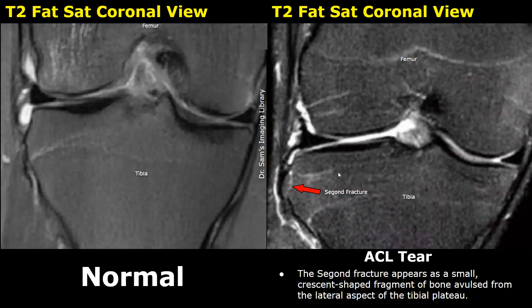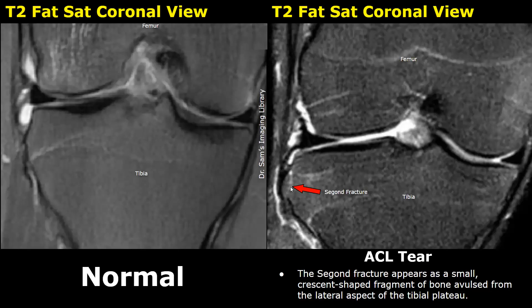Here is another image of a Segond fracture. We can see a small, crescentic-shaped, displaced fragment at the lateral aspect of the tibial plateau. Segond fractures are very subtle and can be easily missed on MRI images. They are usually associated with ACL tears and are best viewed in coronal planes.